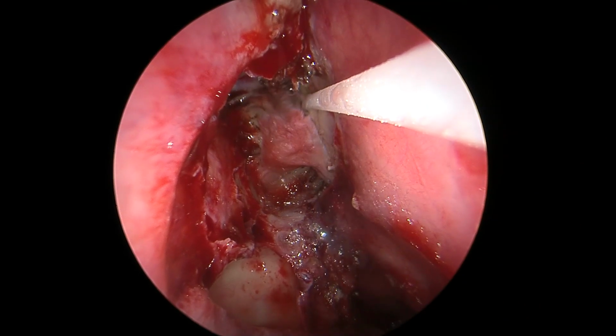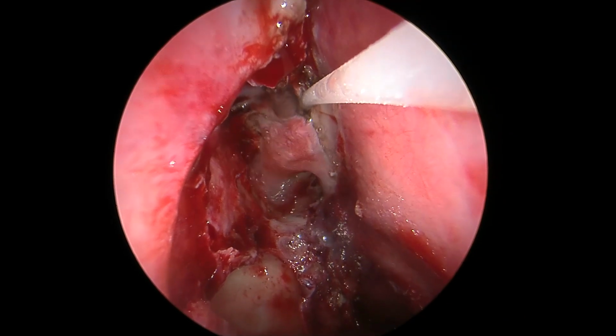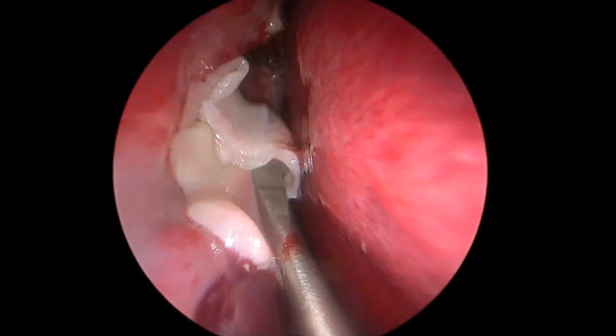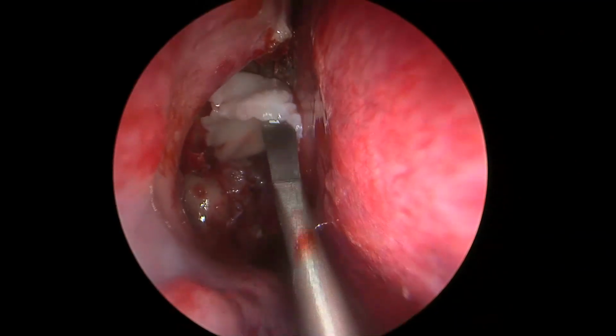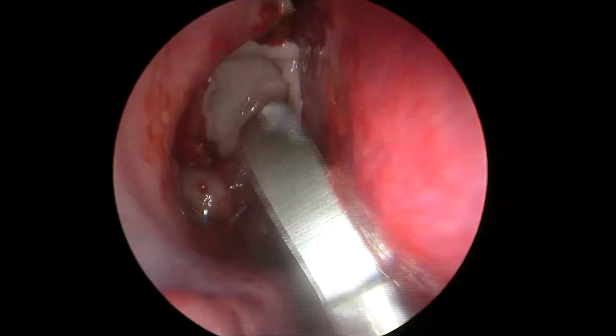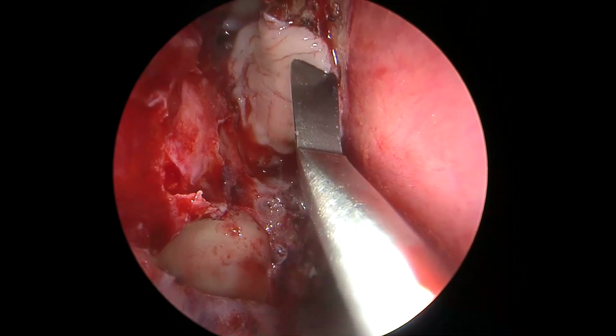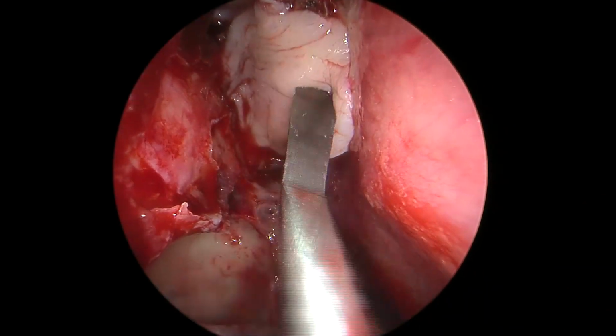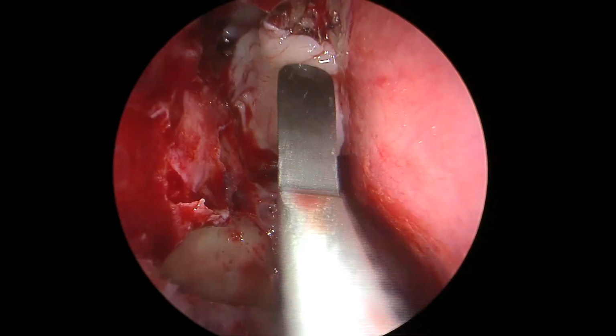Once the fascia graft is well placed, we use tissue glue over this and let it settle down, over which in the end we cover the entire bare bone that we have made using ablation with a free mucosal graft from the excised middle turbinate. This can be taken from the middle turbinate or from the inferior turbinate.